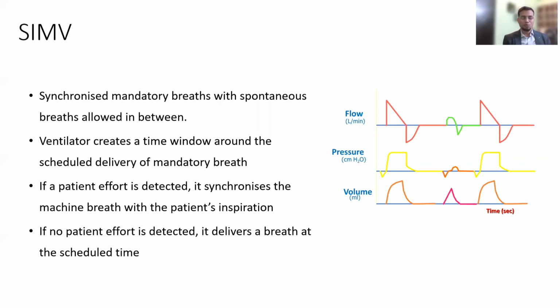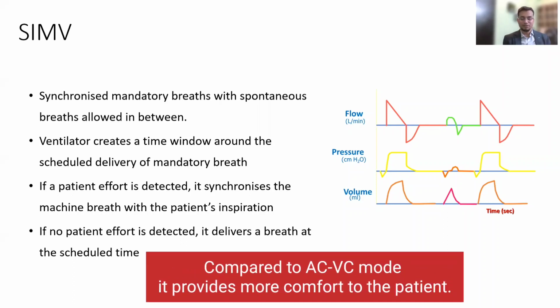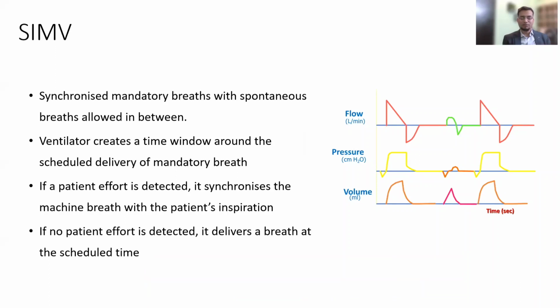The advantage over assist control mode is that SIMV may improve patient comfort and may limit the dynamic hyperinflation, which may occur where the set breath is delivered immediately after the patient's spontaneous effort. So there are spontaneous breaths in between the control breaths. That is the SIMV mode.